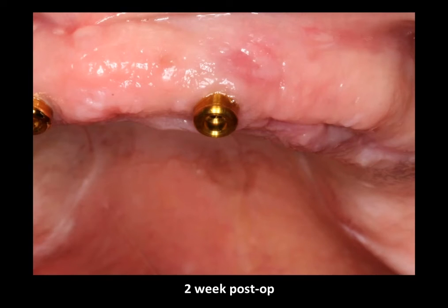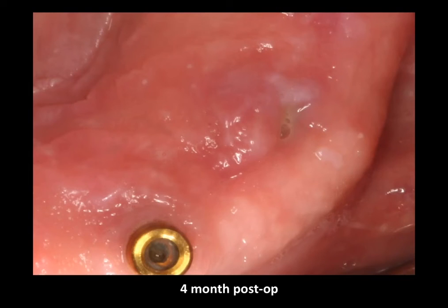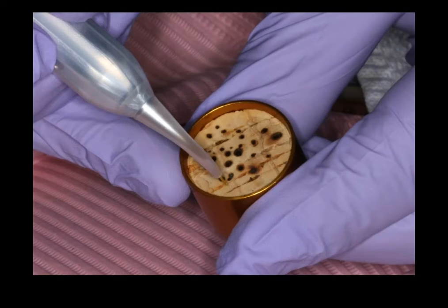2 weeks post-op, we can see that the surgical site is distal. It's on the right hand of the screen. We buried the implant, but we started to get some bone regeneration around the coronal portion of that implant quite efficiently. 4 months post-op, we will again uncover the implant.